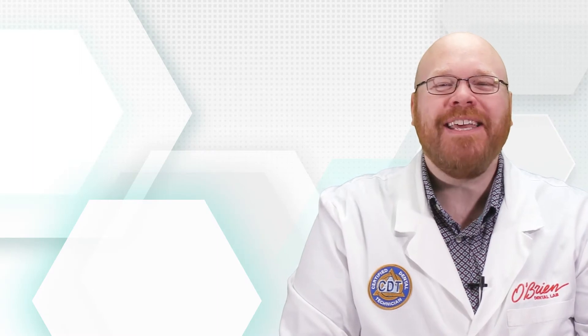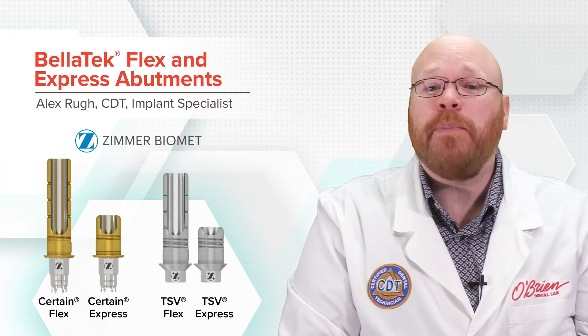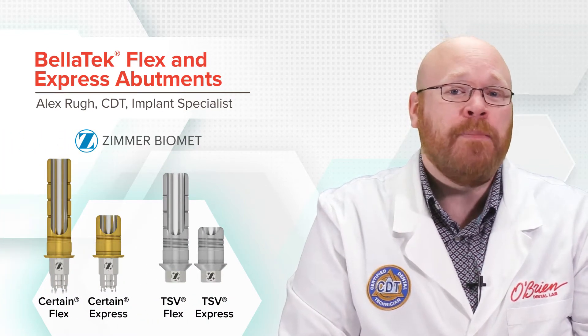Hey everyone, Alex from O'Brien here. Today I want to show you the Bellatec Flex and Express abutments from Zimmer Biomet, which are available for both the Certain and TSV implant lines.